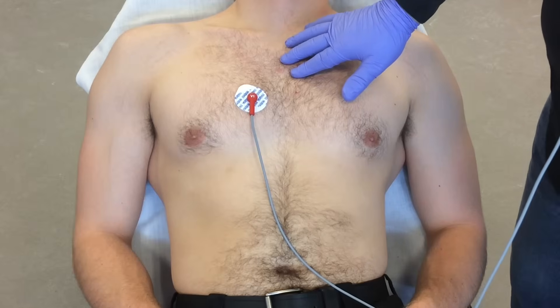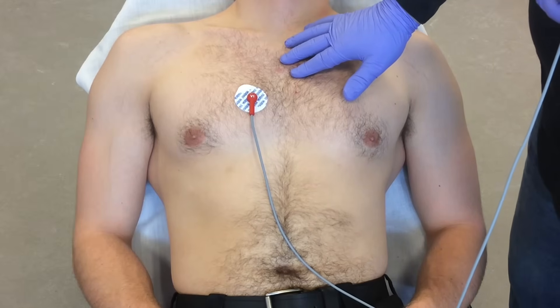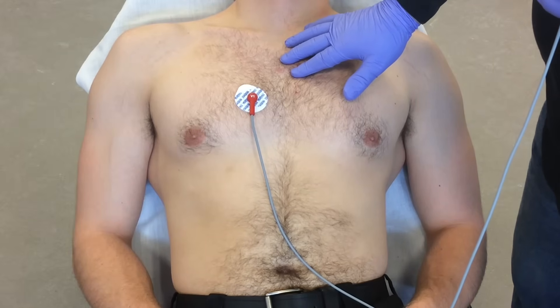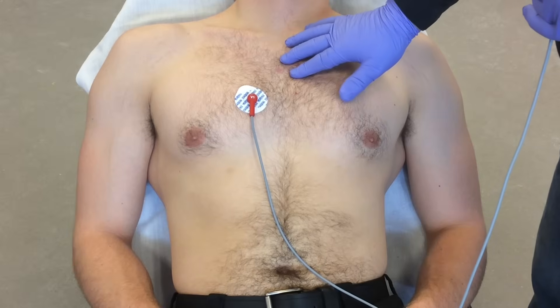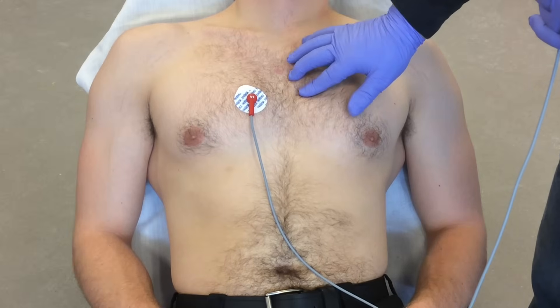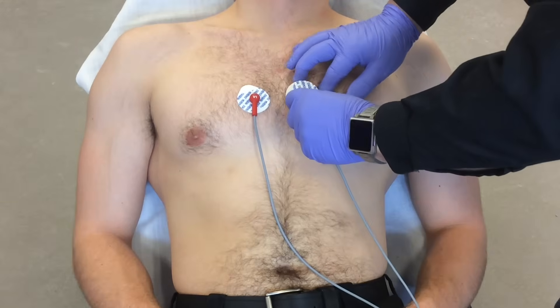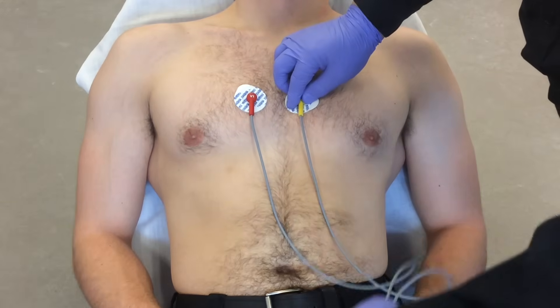Now if you try to palpate it on yourself, good luck — it's like trying to tickle yourself, it's almost impossible. So that's 2, 3, 4 — fourth intercostal space right there.